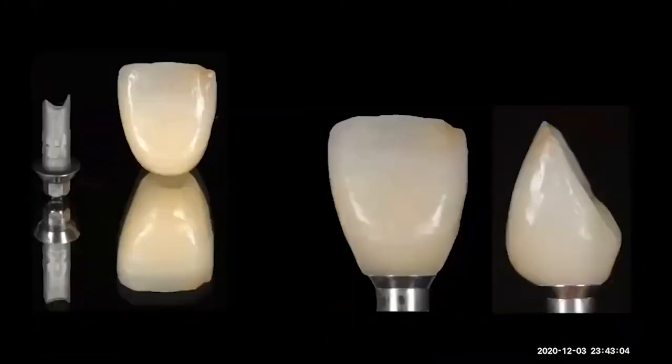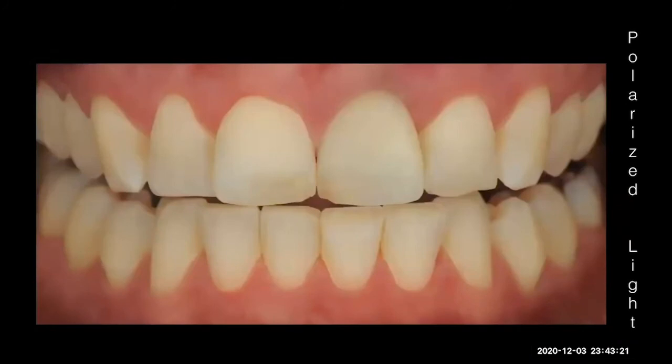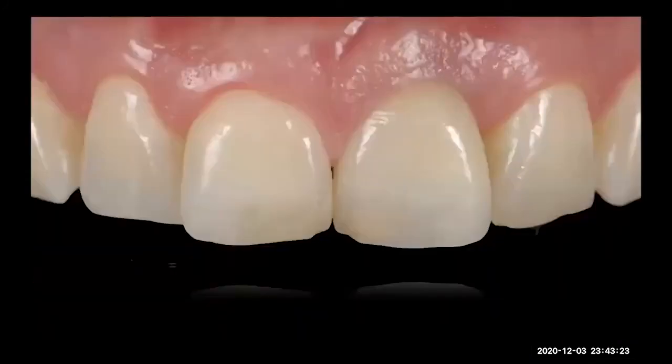And of course, I sent 2 crowns to him in Mexico because we are at a distance. I made 2 crowns and sent 2 crowns to him. He did the cementation, and this is the crown in the mouth. Okay, this is the scoop technique crown in the mouth. This is the polarized picture. This is our 1-year control crown.